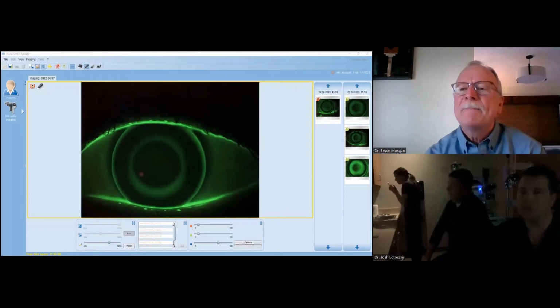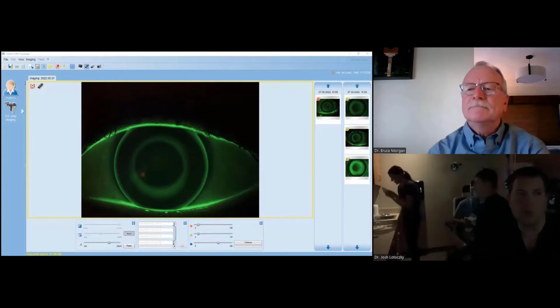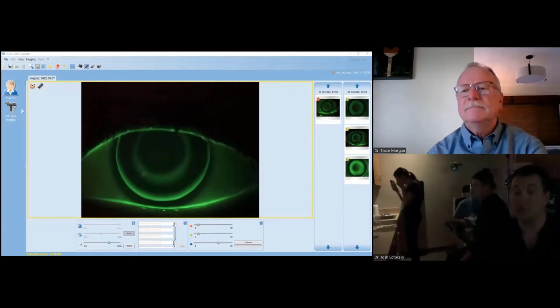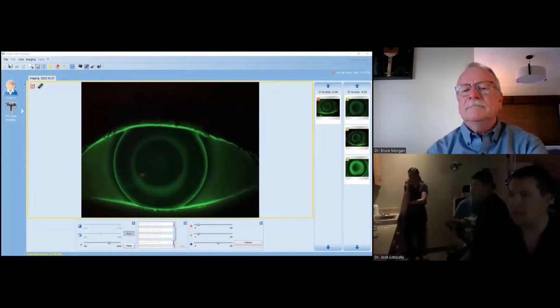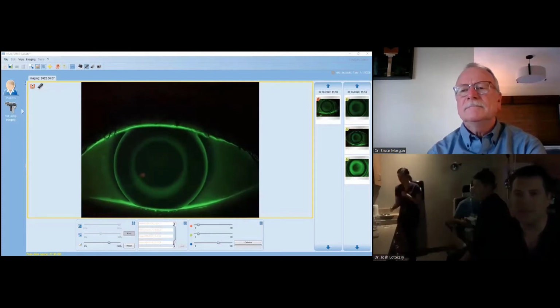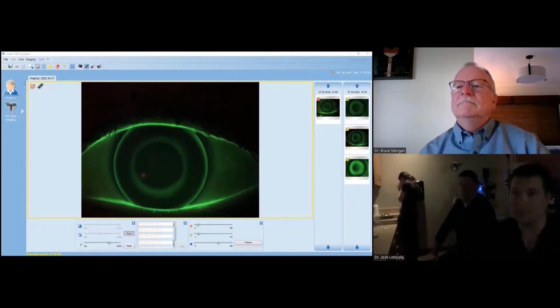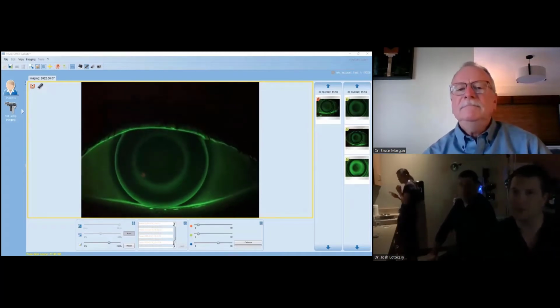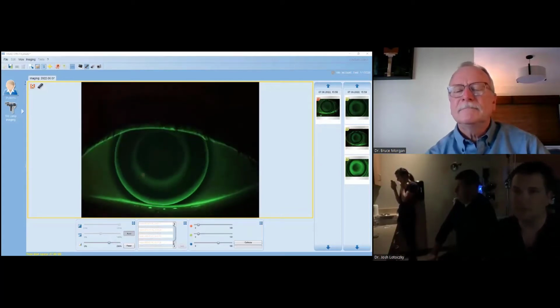I normally do, mainly because of the way the process works with us. For one, it helps the students get more comfortable putting lenses on, especially on a kid, because oftentimes they're a little anxious working with children. But two, I want the child to experience that lens, and they will after the anesthetic wears off. By the time I get in the room and have talked to the parents and looked at the lenses, the anesthetic has mostly worn off, and I can watch how the child is reacting to it. I feel like they get a more gradual experience of it.